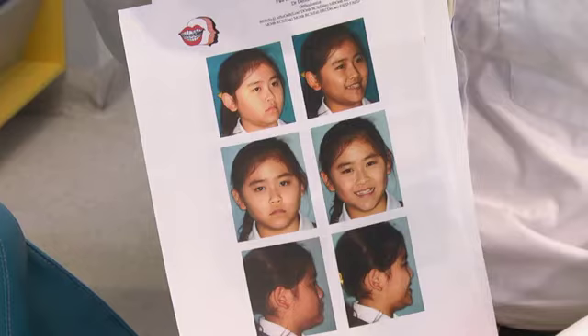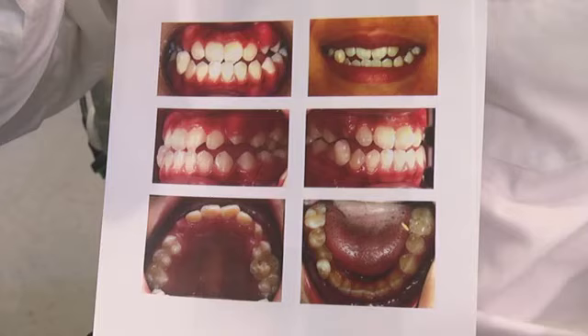So we look at where Monique started — it was a Class III maxillary deficiency case. She's had a bonded hyrax face mask and upper partial bracketing three to three. Today we've taken the hyrax out, so she won't need to wear the face mask anymore. And we're bracketing the 7654 to maintain our arch width. You can see the cross bite that was originally present.